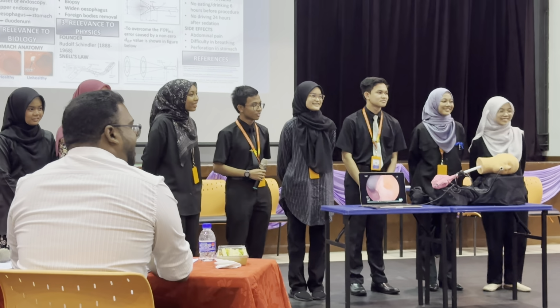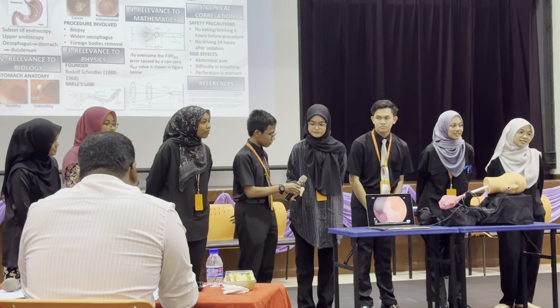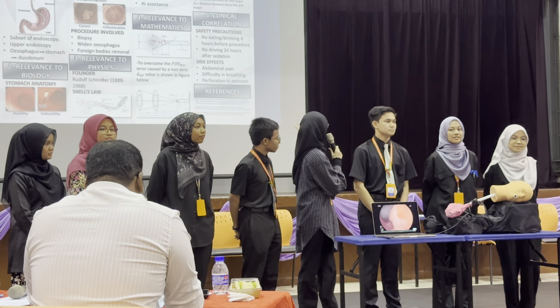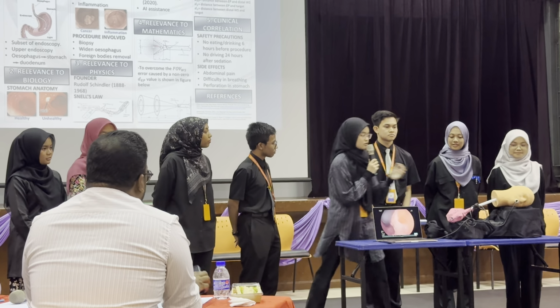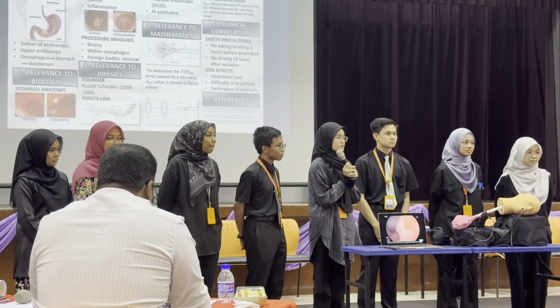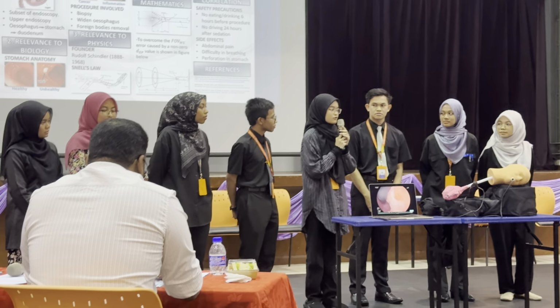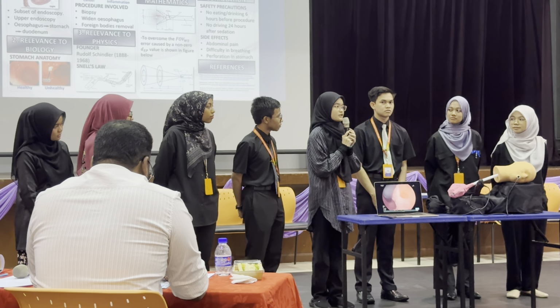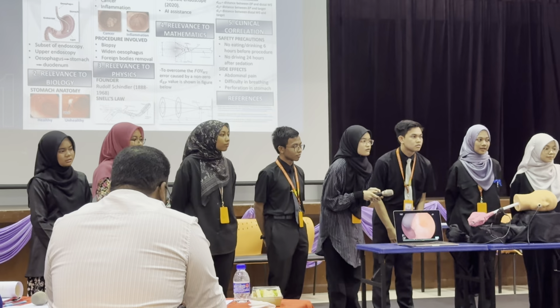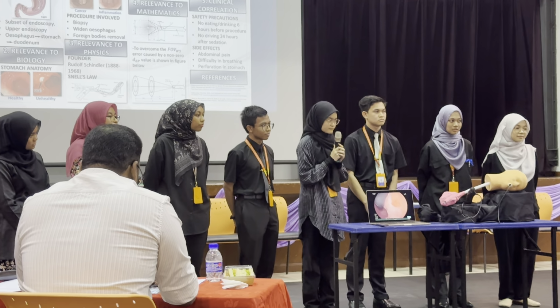Okay, what are the two different types of gastroscope you may find in the hospital? There is the normal gastroscope, which is basically a long wire like this, or you can find a capsule endoscope, which is the latest among these types. There's also a type called pediatric gastroscopy. The initial gastroscopes were rigid, not flexible. Now they are like a tube, so they can flex inside.